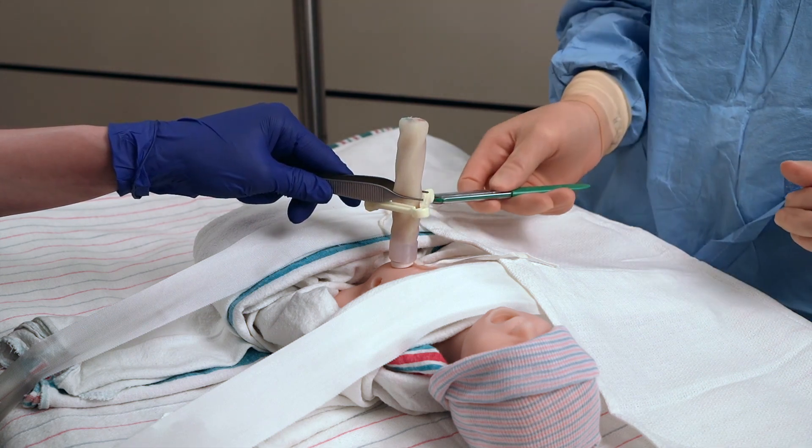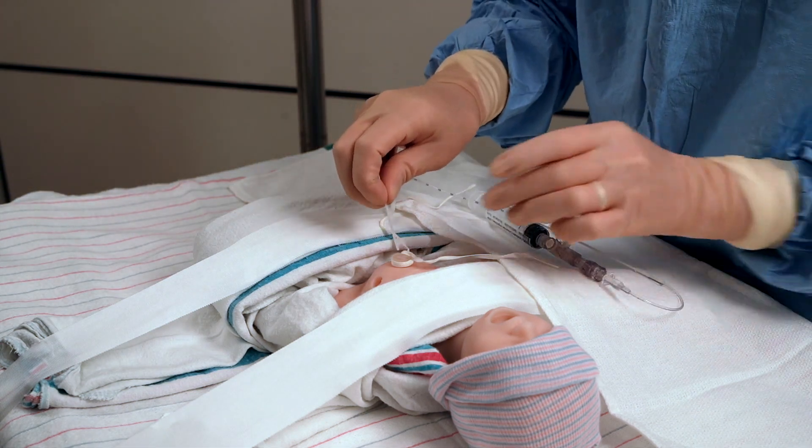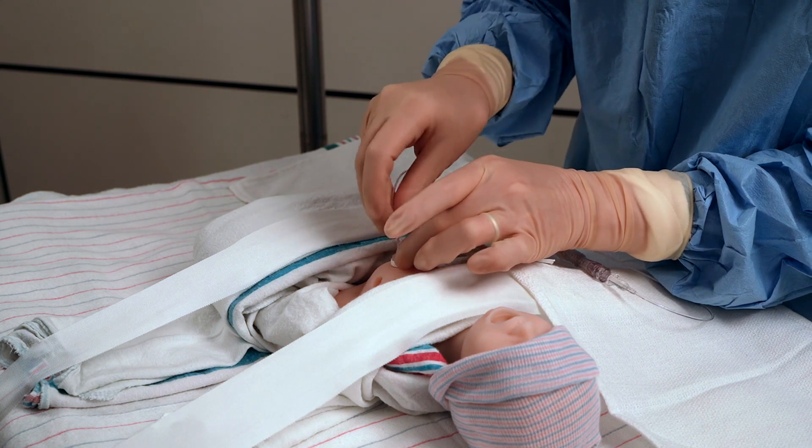The cord will be trimmed using a scalpel. The depth of the catheter insertion will be measured and inserted until blood can be aspirated and the line can be easily flushed.